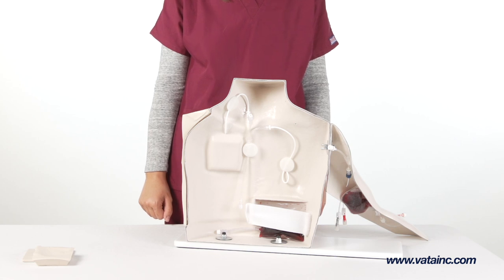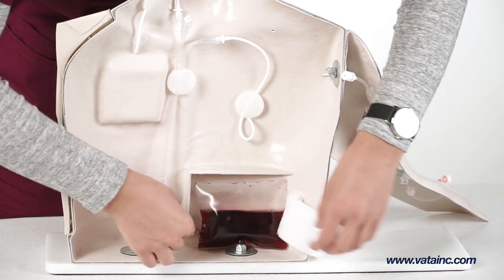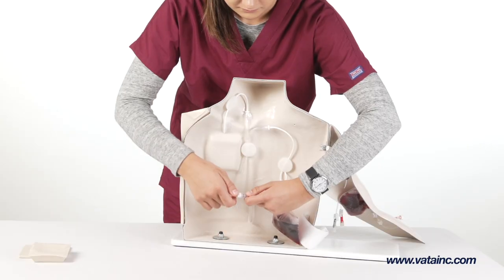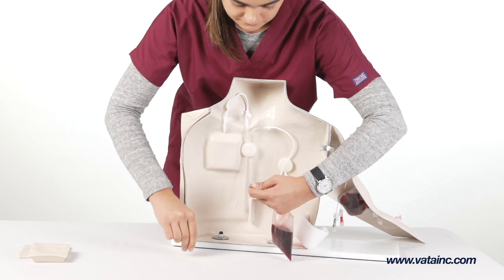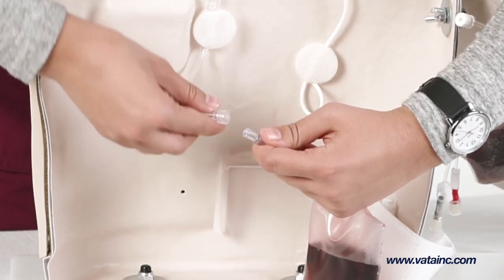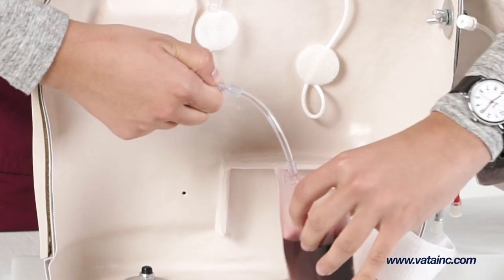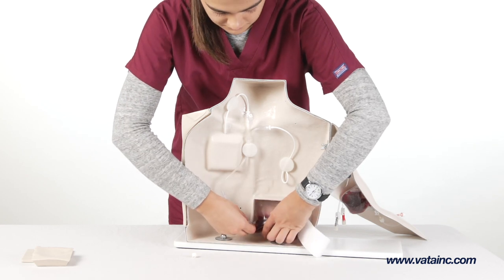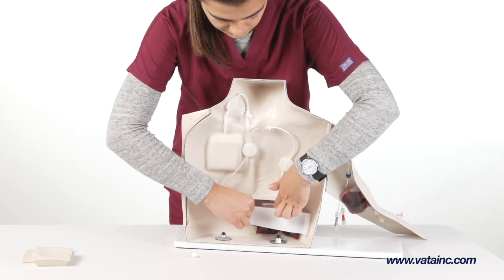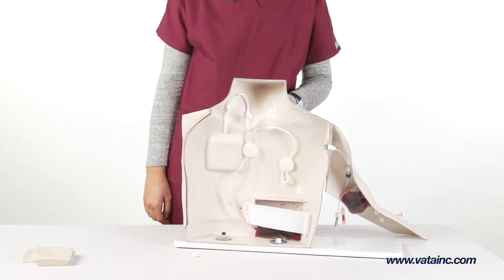To set up, remove the simulated blood reservoir bag from the backside of the torso. Carefully remove the white cap on the simulated reservoir bag, taking care not to let the liquid leak out, and attach the female lure fitting to the male lure fitting on the bottom of the three-way parallel tube set. Next, replace the reservoir bag behind the white retention strap, making sure that the tubing attached to the bag is positioned exiting the bag from the bottom.